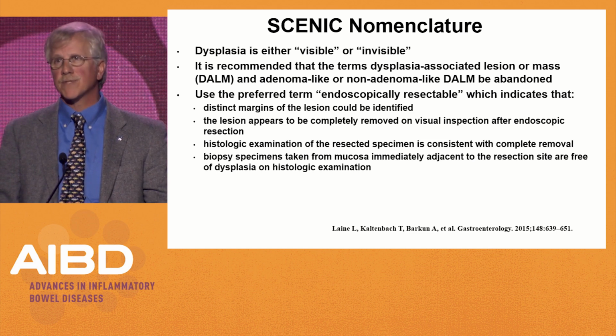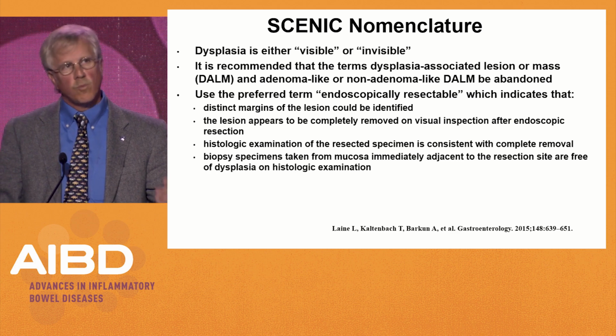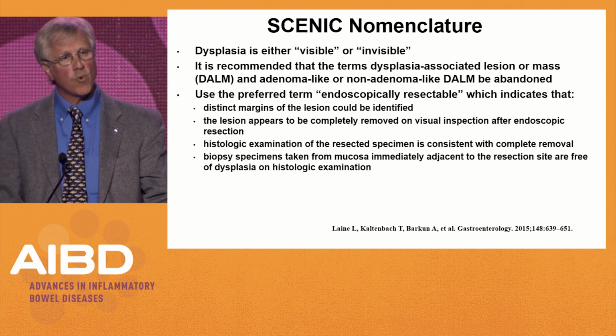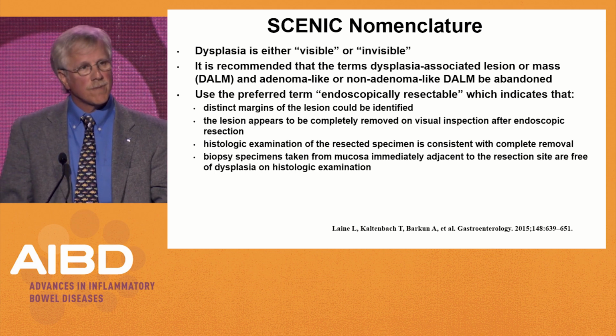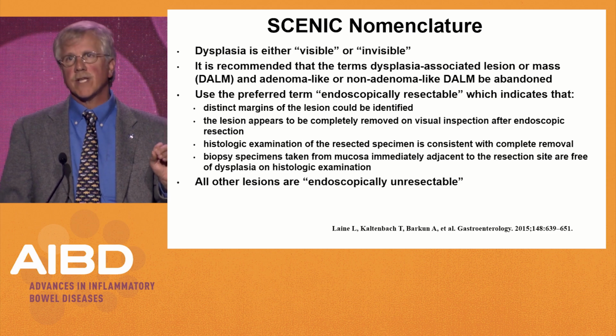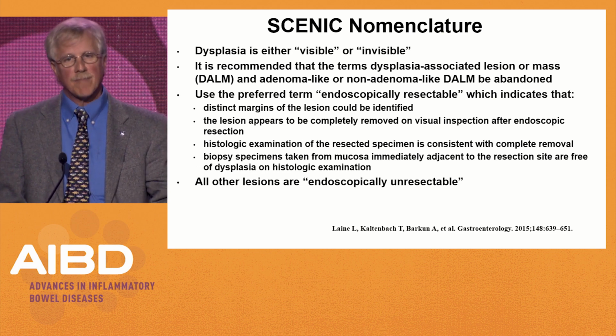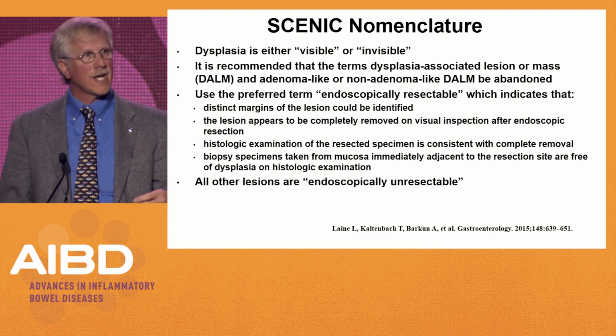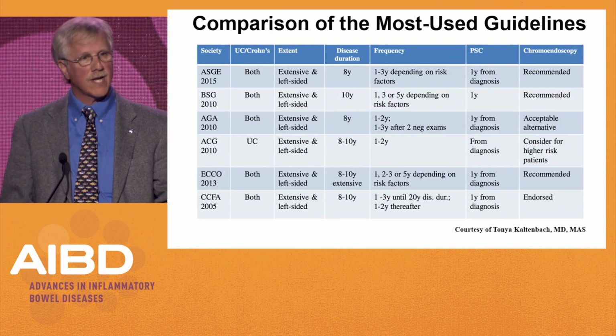I don't necessarily biopsy every single 1 centimeter pedunculated lesion in a patient, but in patients that have more flat lesions, I will certainly biopsy from around the area. So if your lesion does not meet those criteria, it is basically endoscopically unresectable. So I would say no more DALM, no more adenoma-like DALM. It's either a polypoid lesion that's endoscopically resectable or not resectable.